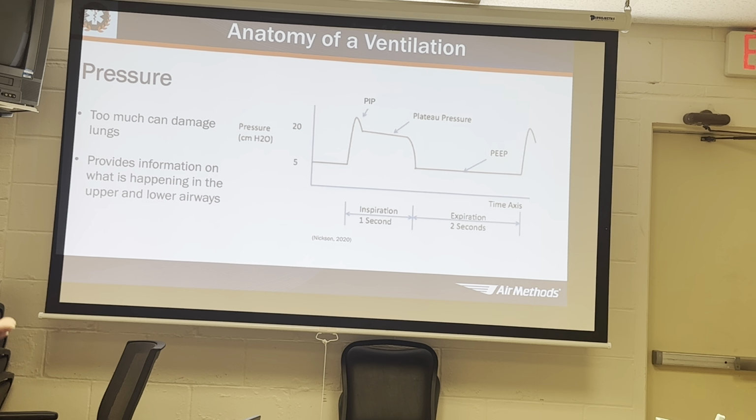Pressure. So yes, too much pressure can damage the lungs. That's what I was trying to show you with this. This is talking about pressure, but to achieve those higher volumes, you may need more pressure. So pressure can cause damage to the lungs, just like volume can. And it provides us information on what's happening in the lower and upper airways.